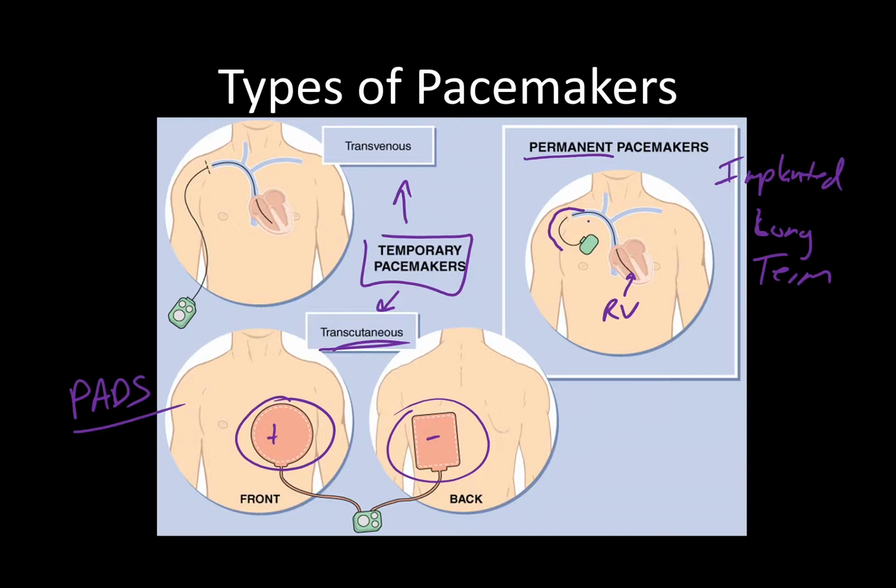The electricity goes through one electrode and comes out the other and runs it through the heart, causing it to contract. They hurt, by the way, so make sure you medicate, because it's like grabbing a hot fence, if for those farm kids who may have done that in the past. So keep that in mind with pads. They hurt when we use that to generate a heart rhythm, a heartbeat.